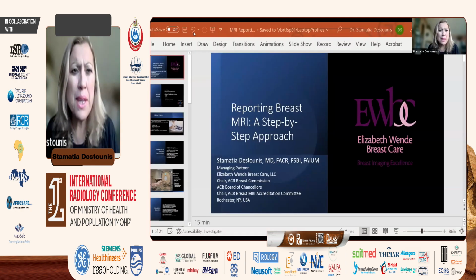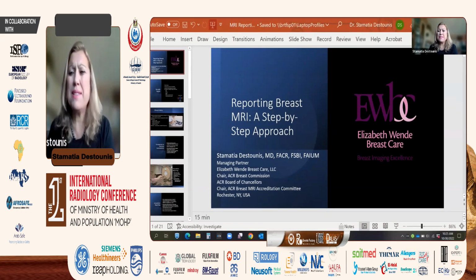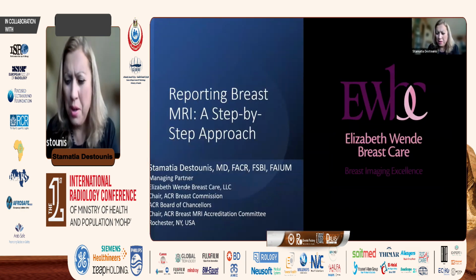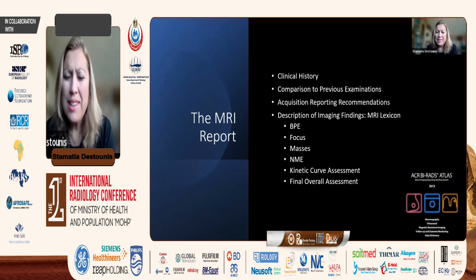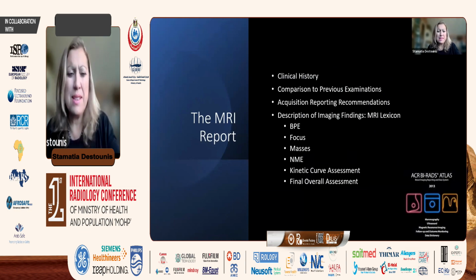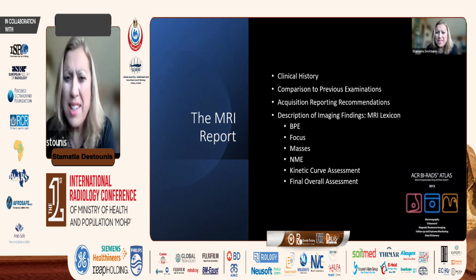We're going to be discussing reporting of breast MRI, a step-by-step approach. So the MRI report needs to have several key sections within it: the clinical history, comparison to prior examinations, whether they're prior MRI or other imaging studies.